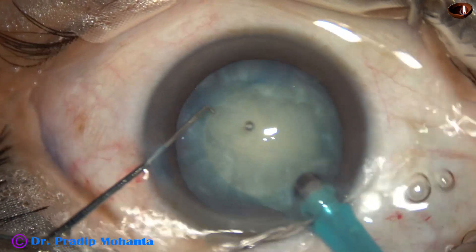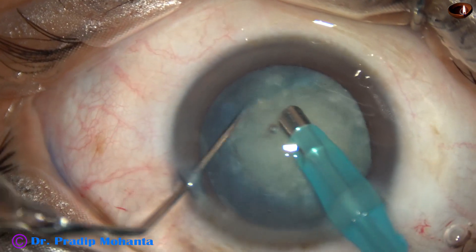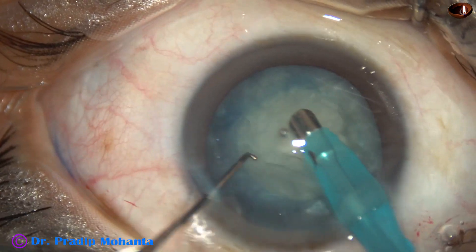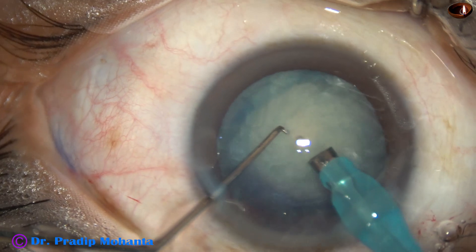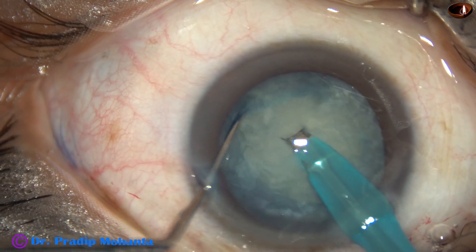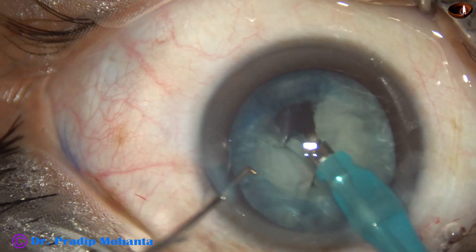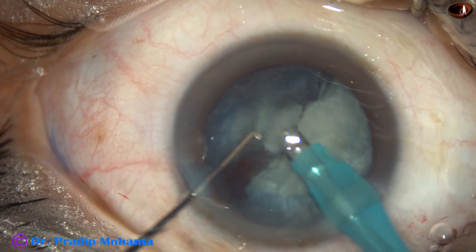And now the tip of the phaco needle goes in. Some superficial cortical lens matter is removed. The nucleus is rotated, and then the handpiece is turned to make the bevel up. This is direct chop — direct submarine chop. This cataract is not hard, so it was easy to emulsify the nuclear pieces.